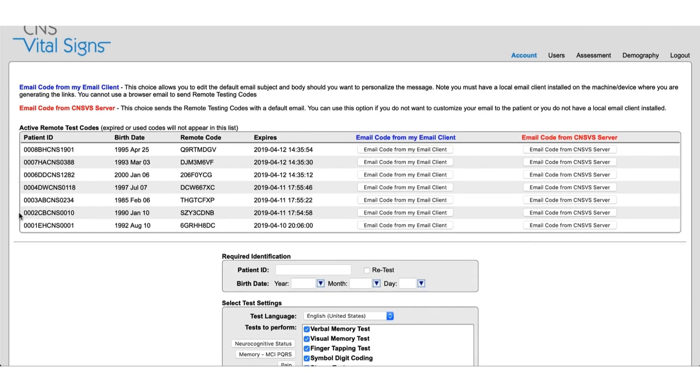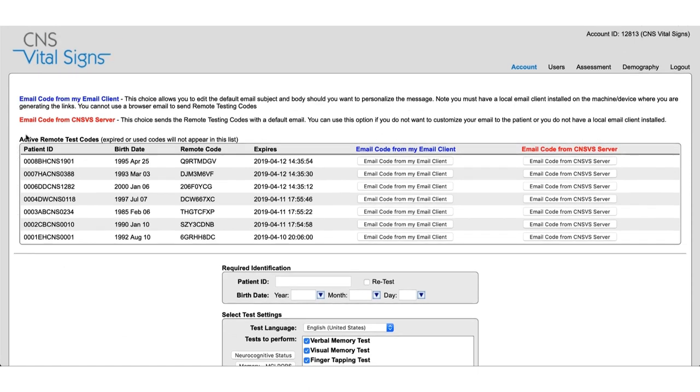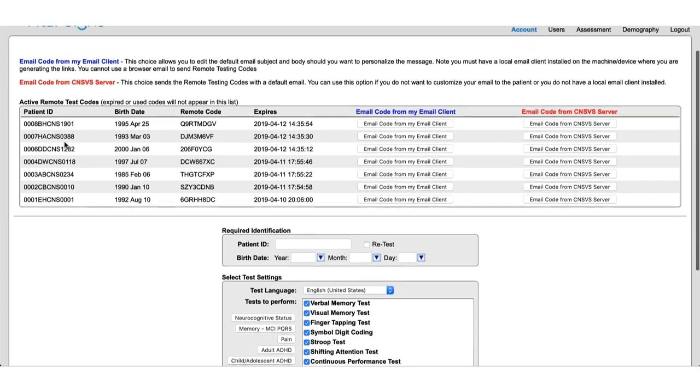Now you'll see here a couple different things. On this top half here we have active remote test codes. These are codes that have already been created and have not been used yet. As soon as a code is used by a patient these will disappear. At the bottom we have an area to create a new remote test code which I'm going to do now.